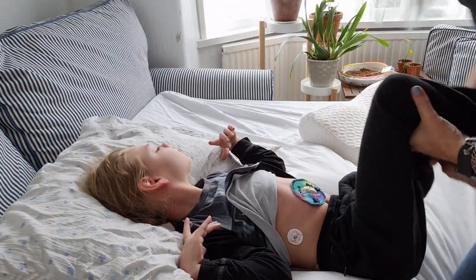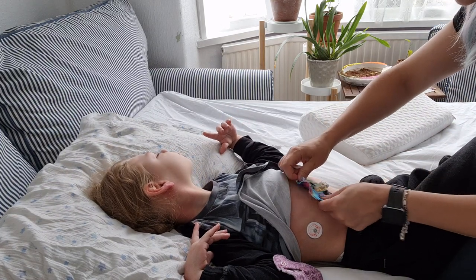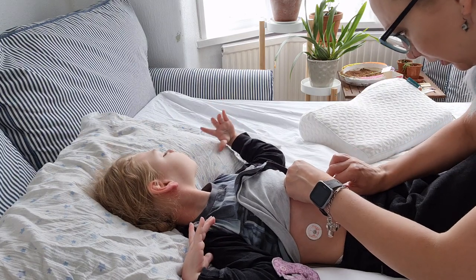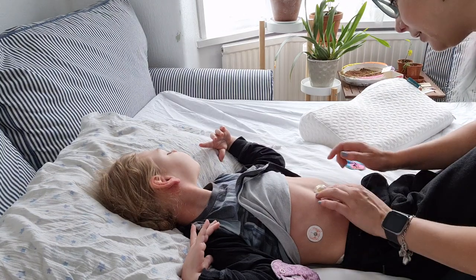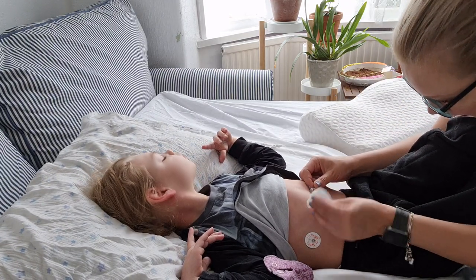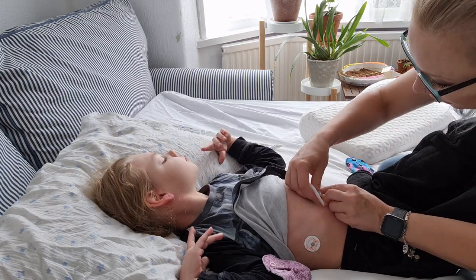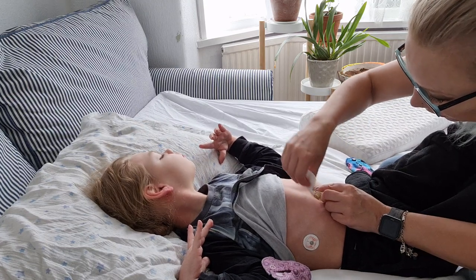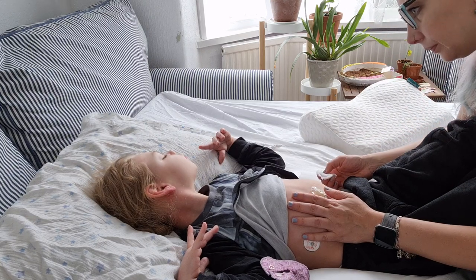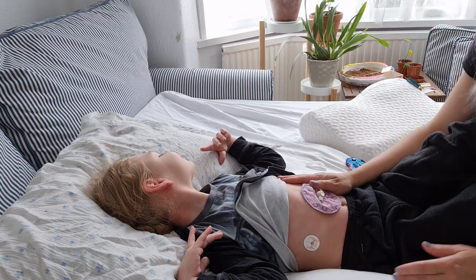Okay, so stoma care. I have a clean tubi pad. I have a damp cotton pad. I remove this stoma. Look at it. It's not very weepy, so that's fine. Just clean off around. Oh, a bit crusty here, isn't it? A little crusty there. So I'm going to leave the pad for a moment. You can move a Mickey button around so you can get to cleaning underneath it more easily. She's not loving this. She's kicking me. Are we done? And then a clean tubi pad. Ta-da! And now to the stickies.